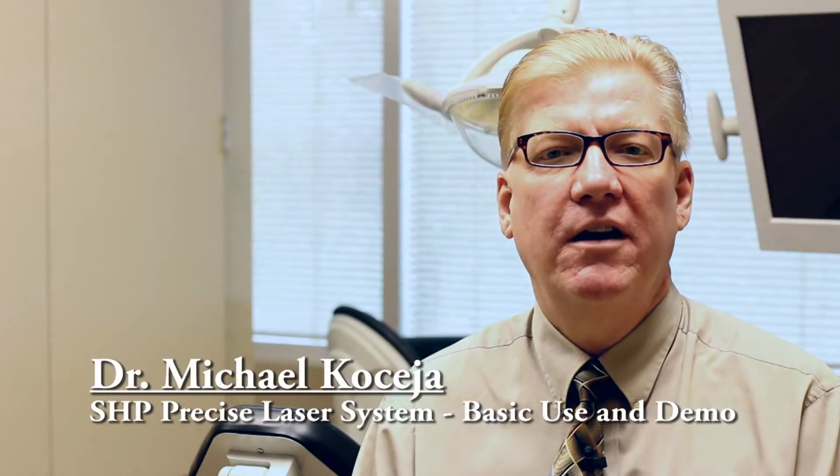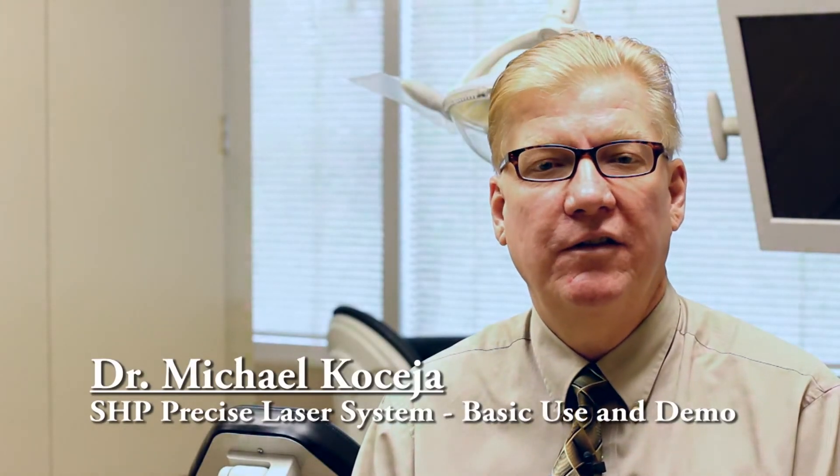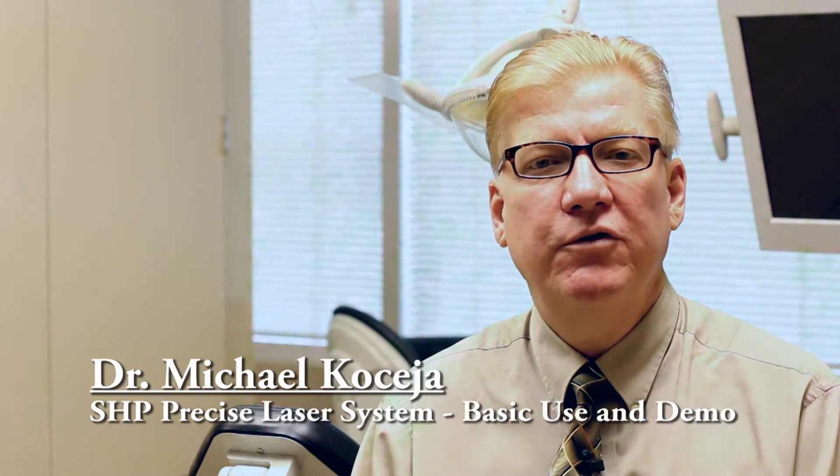Hello and welcome to this video segment on an SHP Precise Laser System. In this video we're going to show the basic use of the laser. We'll go over settings and features of the laser and we'll show you how to do a little cutting. There is a little technique involved in learning how to cut with it, but it's not difficult. Just remember this is different — it's not a scalpel, it's not an electrosurge, and you have to practice a little bit before you get proficient at using it.